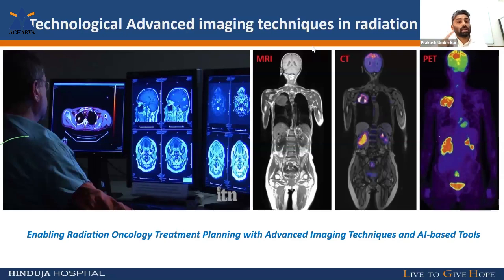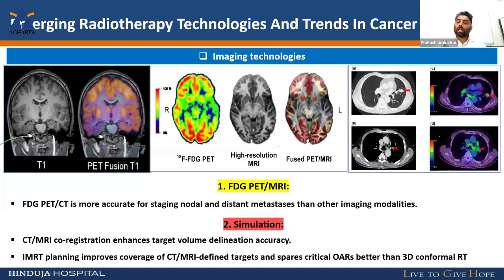But if you look at the MRI brain scan, we get all the parameters, good enhancement of the anatomy and better visualization of the disease, tumor and any changes of the brain. We get that only with MRI. With this imaging, in radiotherapy, we fuse it with the CT scan from our simulation. Fusion means one is your MRI images, one is our planning CT scan images.